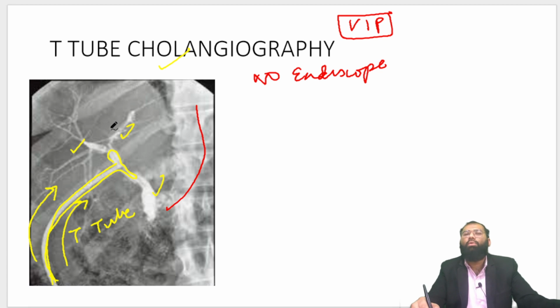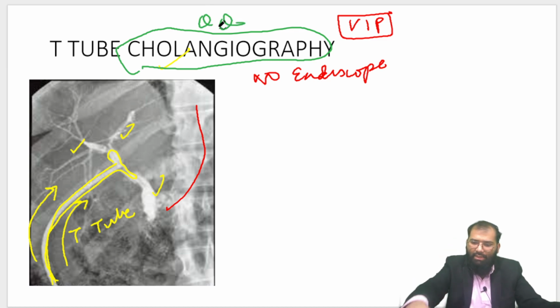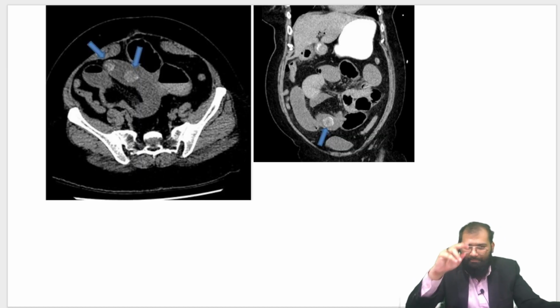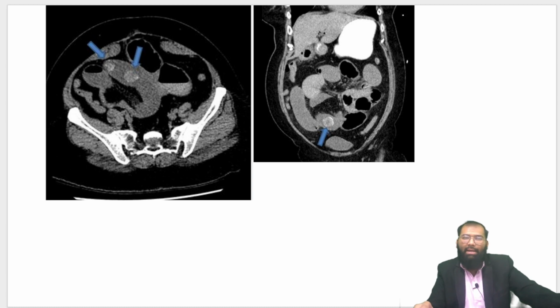Very important, routinely the pancreatic duct will not be seen with T tube. It is mainly cholangiography. It is not cholangiopancreaticography. Very important. Remember this. Okay. Now let us move ahead. Now here is a beautiful question for you. Let us go part by part. So I'll tell you the history of the patient.